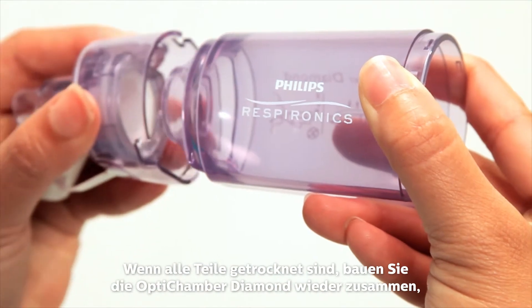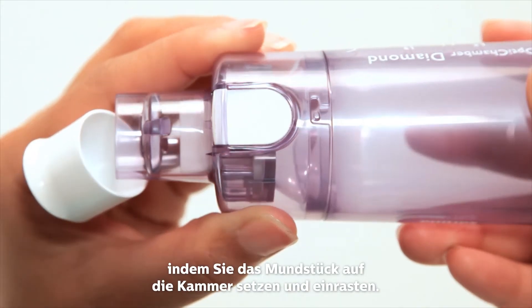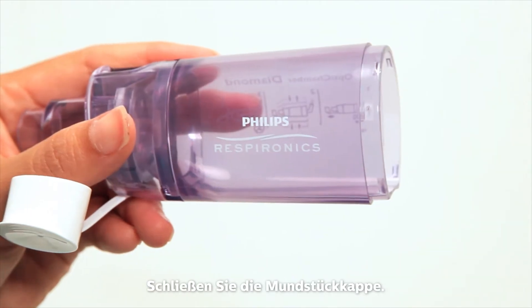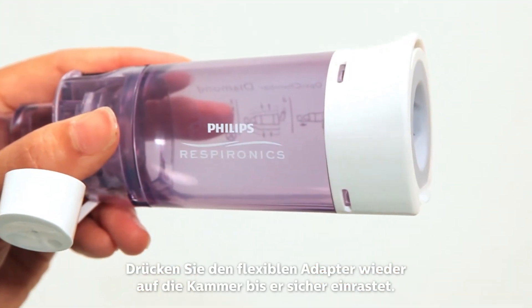When the parts are dry, reassemble the Diamond by aligning the mouthpiece onto the chamber. Rotate to lock. Replace the mouthpiece cap. Place the flexible adapter onto the chamber and push until it snaps on securely.